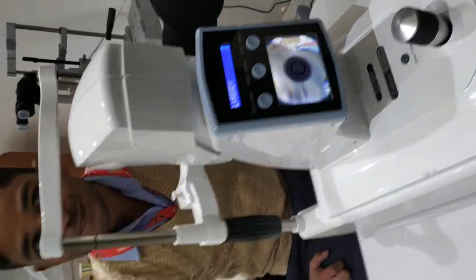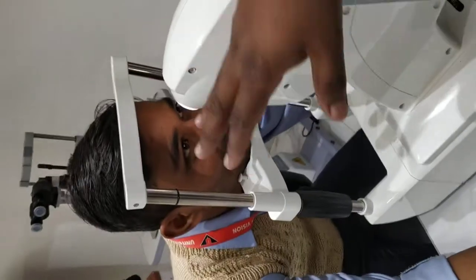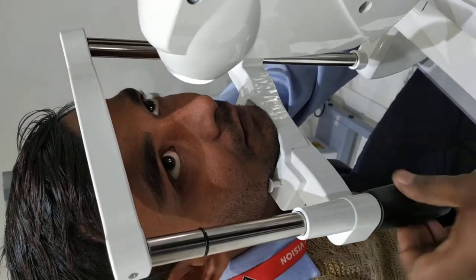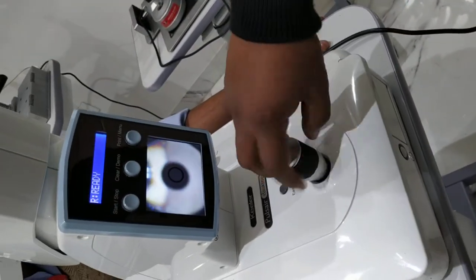Now keep your chin here. Before testing, we will check that the patient's point should be here. We will check the patient's point here. After this, you can see that the patient's alignment is in manual mode.